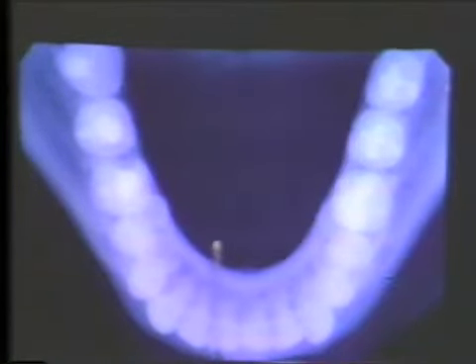The floor of the mouth is well visualized to show foreign bodies or calcification lodged in the soft tissues, glands, or ducts. The bucco-lingual relationship of impacted or supernumerary teeth or other pathologic lesions can be evaluated in this type of occlusal radiograph. In case of fractures, the degree of displacement can be determined.